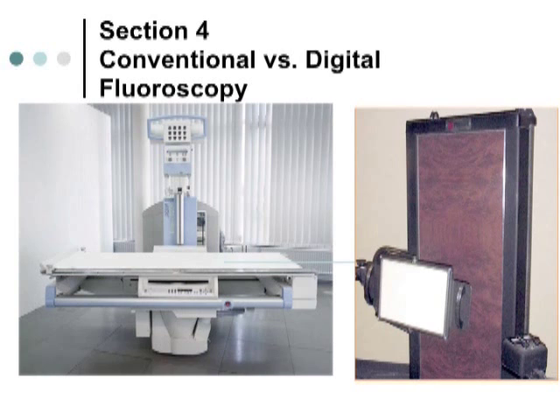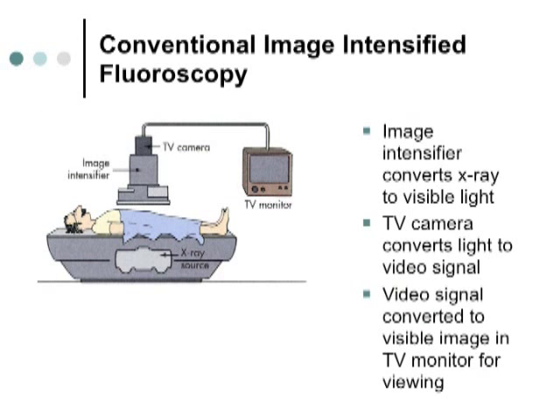This is the new digital fluoroscopy units that they're using in most hospitals today. So we've come a long way, baby, right, in the last 50 years. Okay, so some of you are familiar with the conventional fluoroscopic X-ray room. A lot of times in a department we call it an R&F room. It does radiographic exposure and fluoroscopic exposure, so it has a separate X-ray tube.